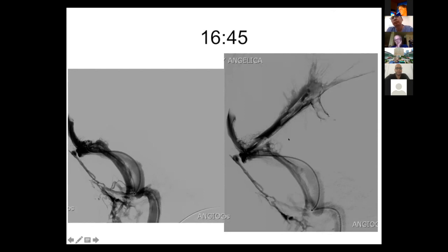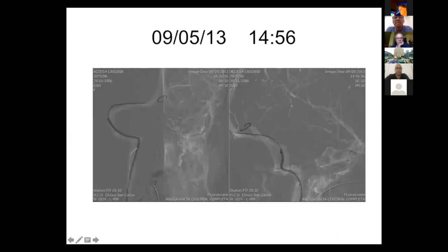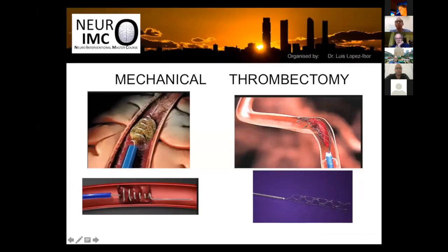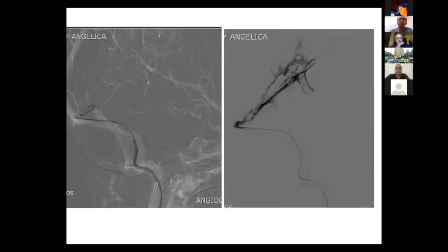I decided to treat with heparin, ReoPro, and remove the thrombus with the stent retriever to maximize thrombus removal. This is a road mapping image. It is difficult to navigate in the straight sinus as it is closed. A guidewire loop was used to navigate into the sinus and remove the clot. The microcatheter was advanced into this segment and also further distally to perform perfusion with heparin.